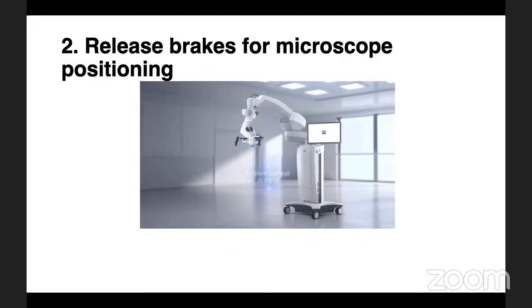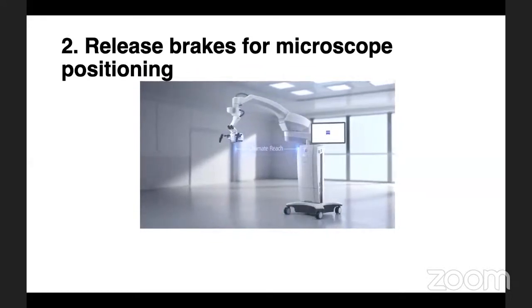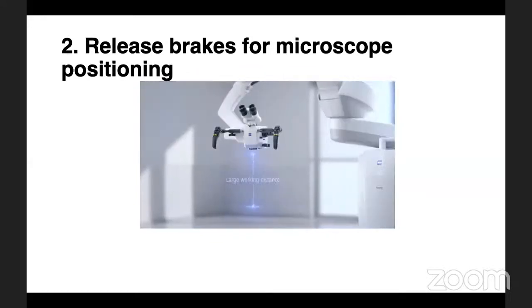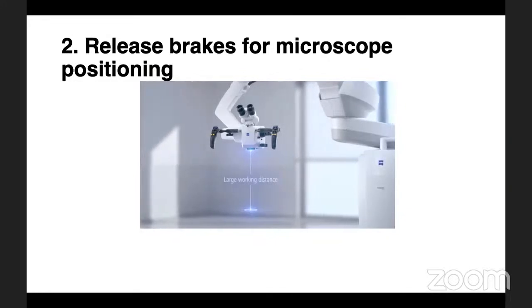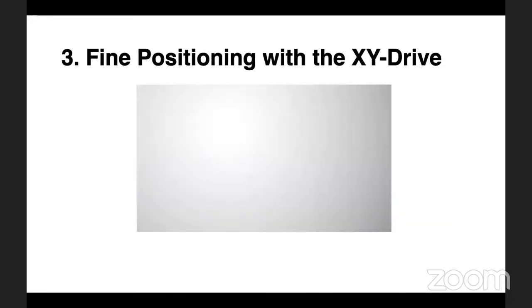So this is basically releasing the brakes and putting the microscope into a comfortable position with comfortable working space, overhead clearance, and a long working distance. Next comes the fine positioning of the microscope with the XY drive on the horizontal plane.